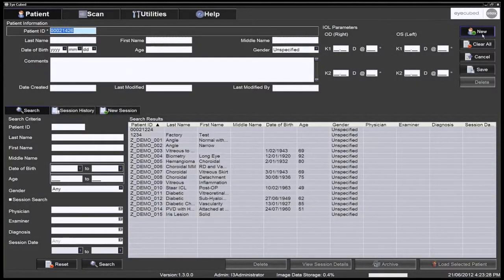As an alternative, the system can automatically generate a new patient ID. See the option in the general tab under utilities. The new patient data can then be entered, followed by clicking Save.